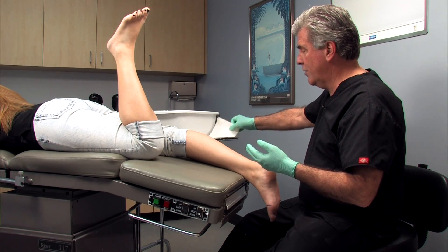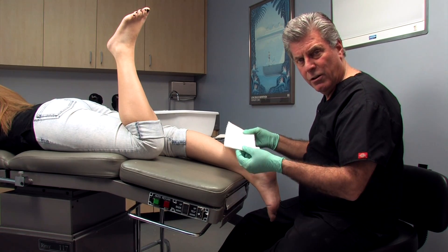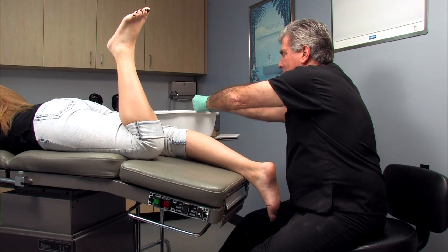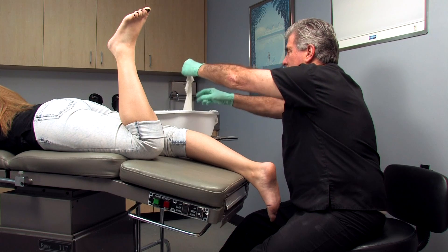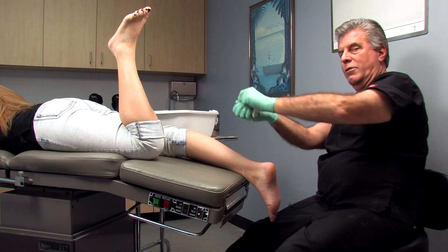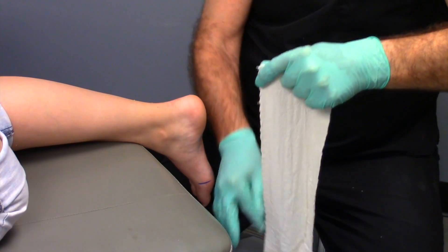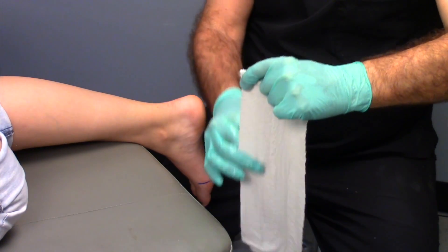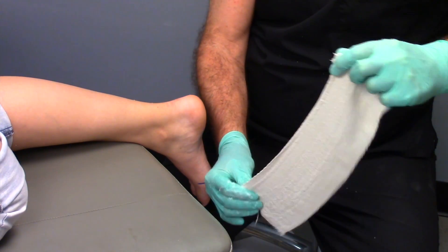We're going to take two strips of plaster and dip them into water at the same time so that they cure at the same time. We dip and lay them at the edge of the tray so we can get both started simultaneously. Then we take one of those strips and begin to rub the water into the plaster. The more you get it rubbed in and activated, the faster and more uniformly it's going to dry.